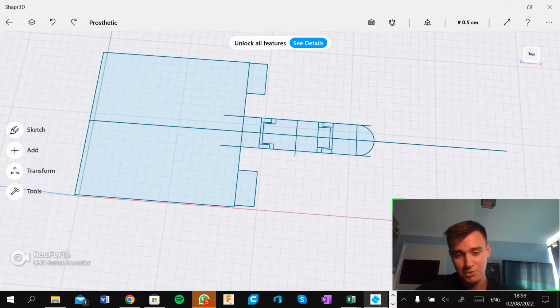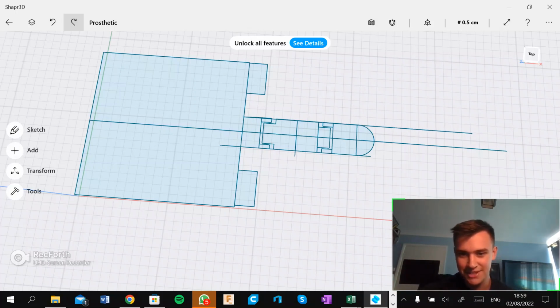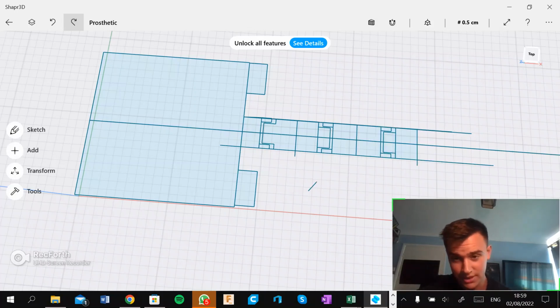And so this was my original design, but I realised it's too short. There's only 2 hinges of movement, which, yeah, just wouldn't work. You'd be trying to lift something up just like that. That just wouldn't work, and I discovered that eventually. And so you see me changing the end length I wanted there. There we go. I've mirrored it back on to add another joint. And there we go. That's what I decided on.